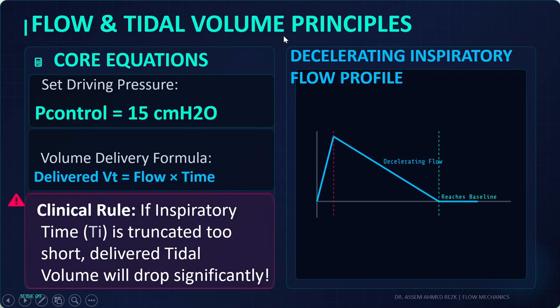Flow and tidal volume principles. The core equation: you set the driving pressure equal to 15 centimeters of water. Volume delivery formula: delivered tidal volume equals flow multiplied by time. This is your curve.